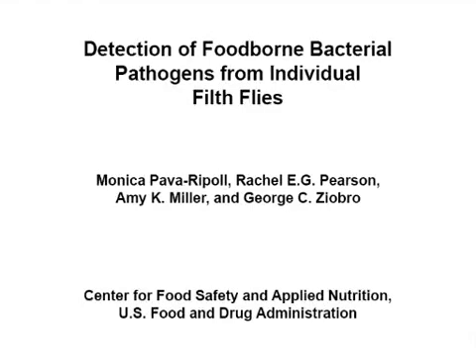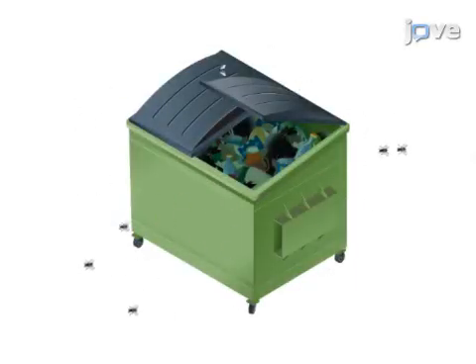The overall goal of this procedure is to screen for the presence of bacterial foodborne pathogens from the body surface and the alimentary canal of individual flies, using a commercially available PCR-based detection system. This is achieved by first collecting wild flies from the trash area of restaurants.